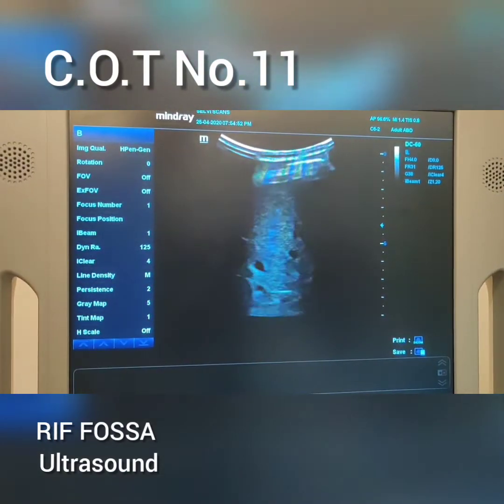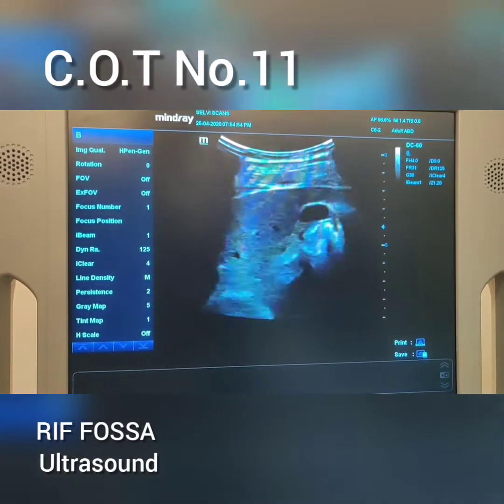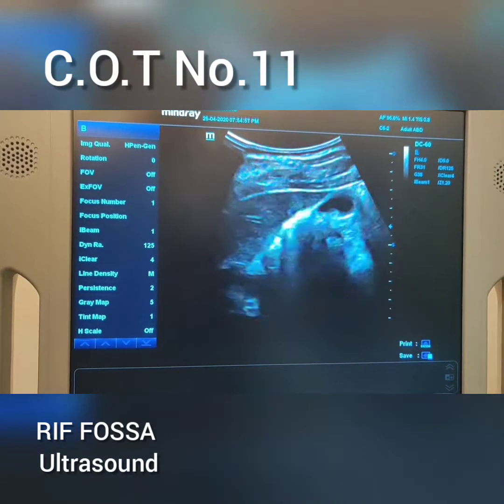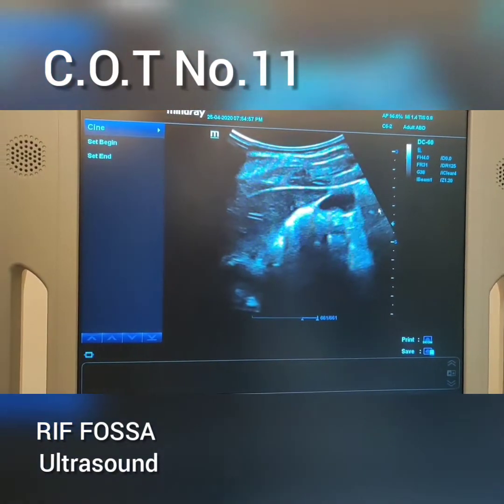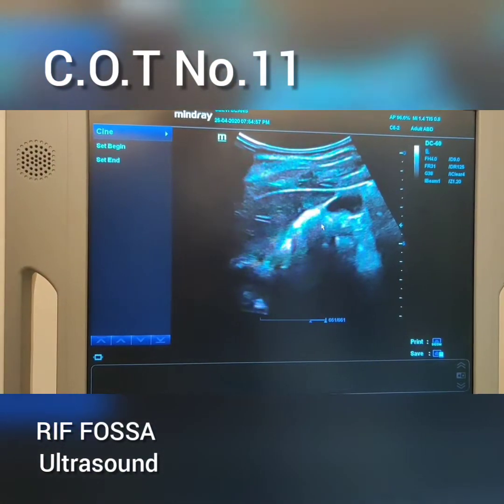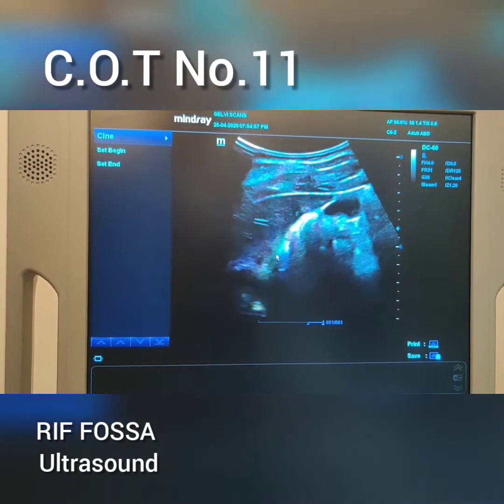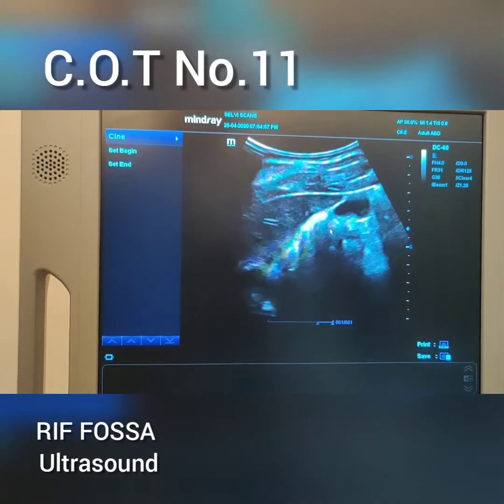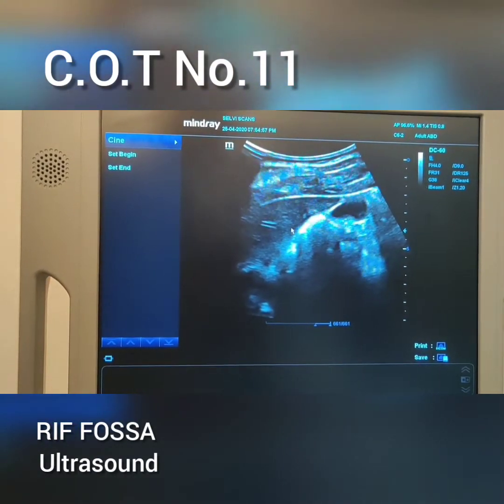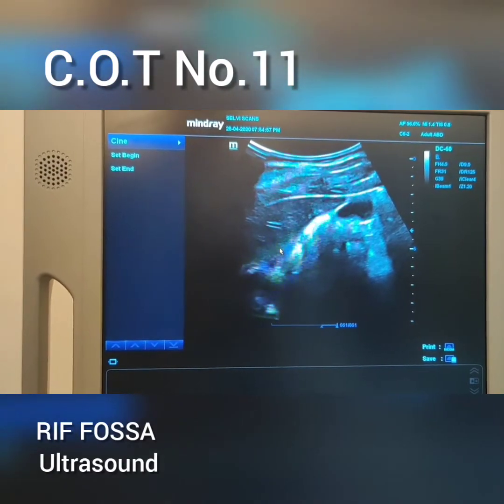Now, that is liver. I'm going to keep it transverse. When I come down, you can see a lot of hyperechoic structures. That hyperechoic structure is going to be the hepatic flexure of the large intestine. The large bowel will be more hyperechoic.